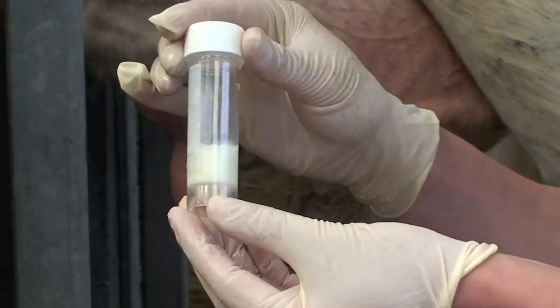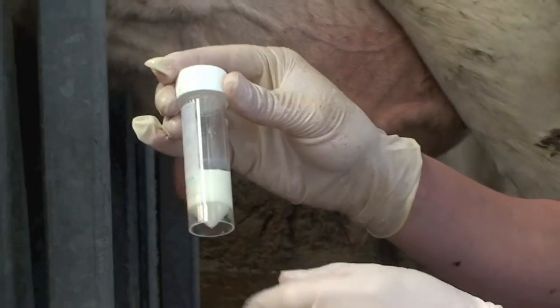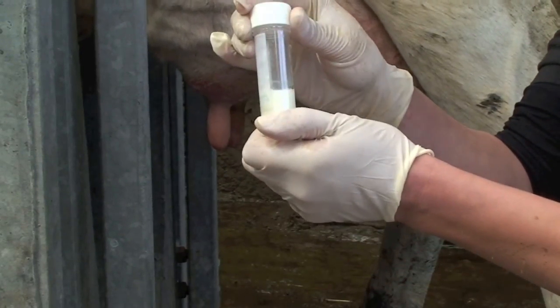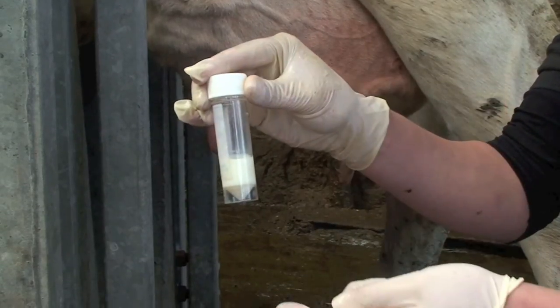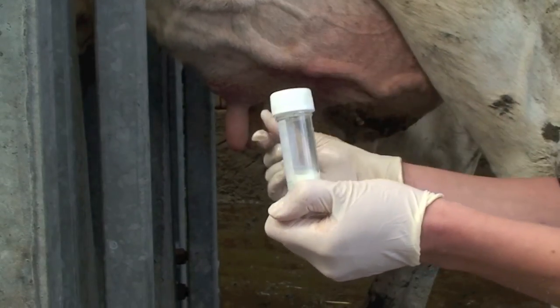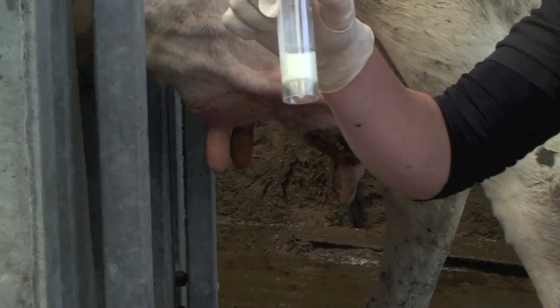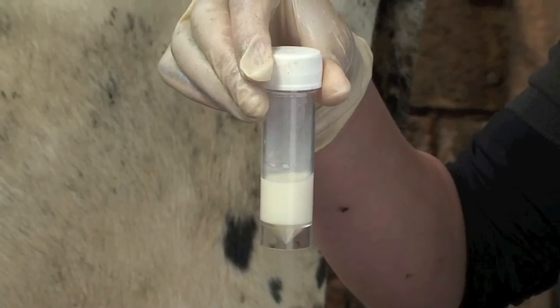Sometimes it's worth getting an extra millilitre if you're going to freeze it, but other than that, that's all we need to send away to the lab. Don't worry about filling the pot up — each time you take a squirt from the cow that's how you risk contaminating your sample. A small amount is all they need to check for bacteriology.